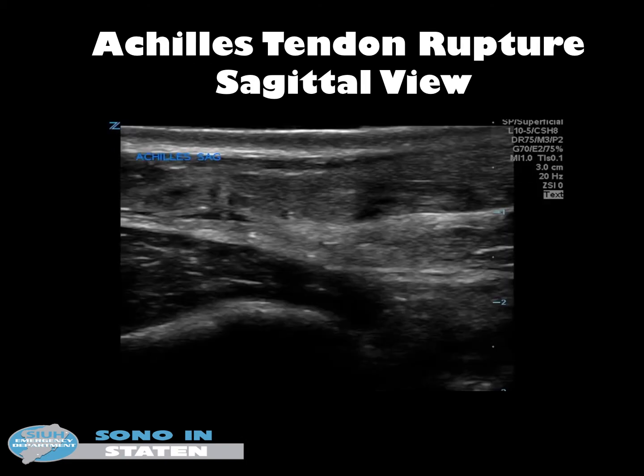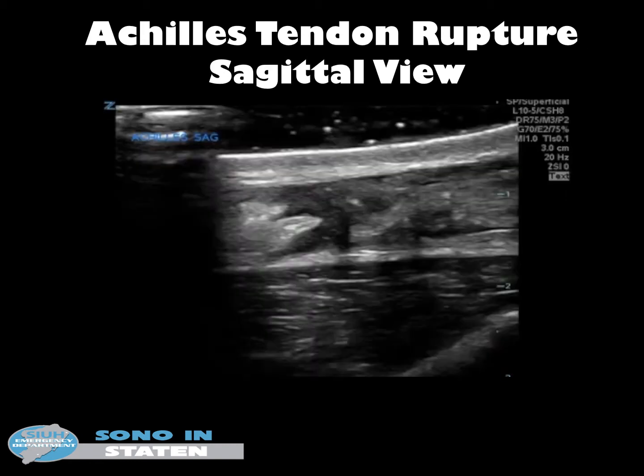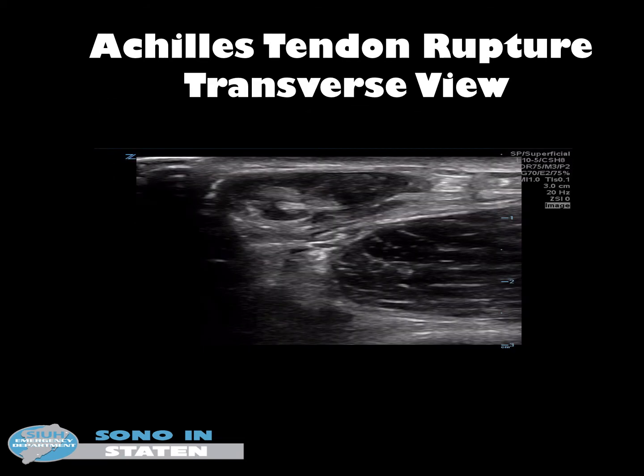Partial thickness tears can appear as areas of hypoechoic or anechoic echogenicity within the tendon, disrupting the fibers. Full thickness tears have completely disrupted tendon fibers and can have tendon retraction or changes in the contour of the tendon. In transverse view, what you'll see is a mass-like appearance, typically representing an Achilles tendon rupture.